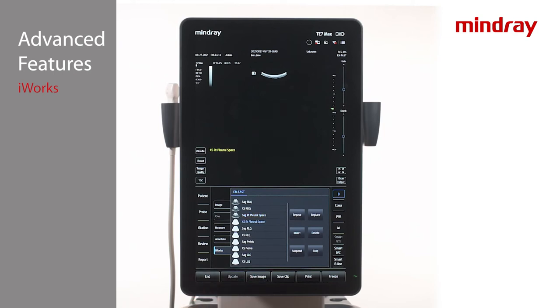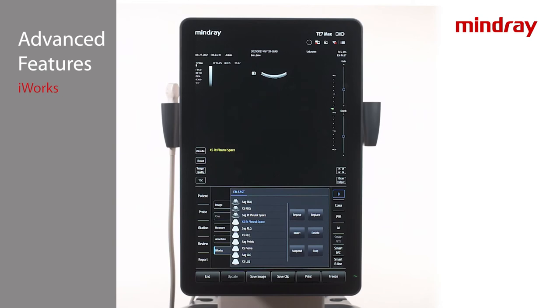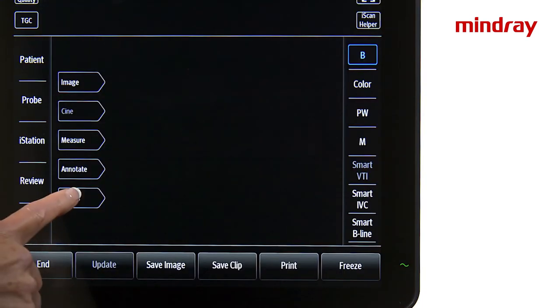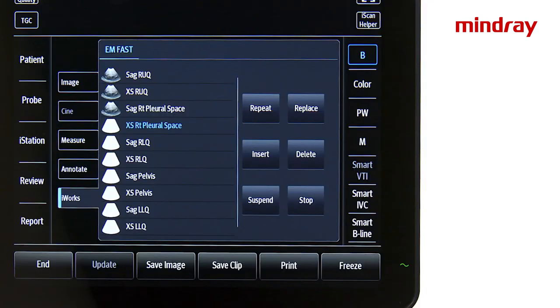The system will automatically advance to the next view. Proceed in this manner until the iWorks protocol is completed. iWorks is designed to offer flexibility while scanning. To the right of the views, there are tabs available to repeat, replace, insert, and delete a view. There is also the option to pause the iWorks protocol if needed and resume later. To pause, tap the Suspend tab. To resume, tap the iWorks tab again and the protocol will pick up where you left off.